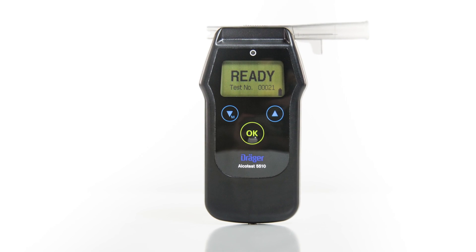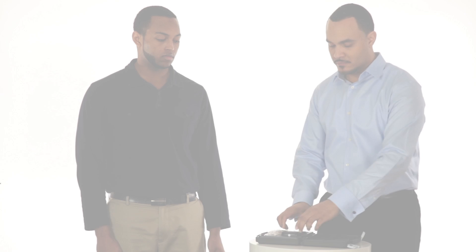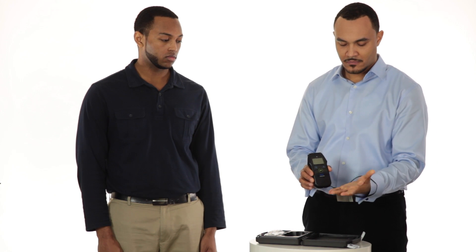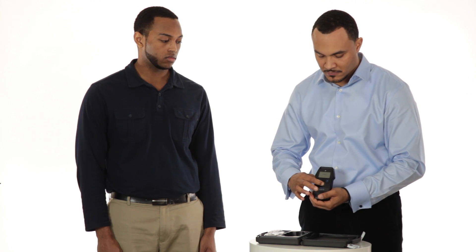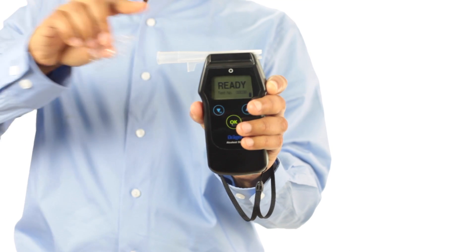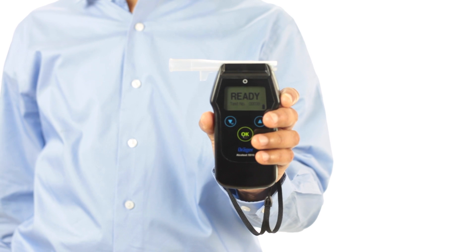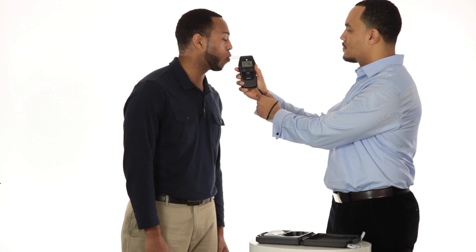Welcome to the training video for the Draeger Alkotest 5510, one of the most accurate and easy to use hand-held breath alcohol screeners available today. Maintaining public safety is a challenging job, and the Alkotest 5510 is designed to make your role easier. Whether for law enforcement or Department of Transportation testing purposes, screening for breath alcohol can be done in a matter of seconds.